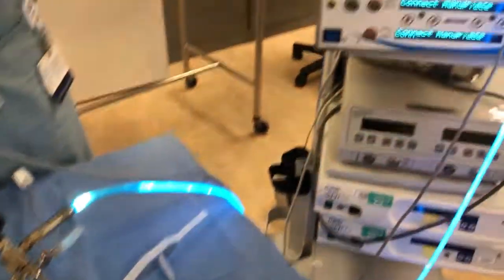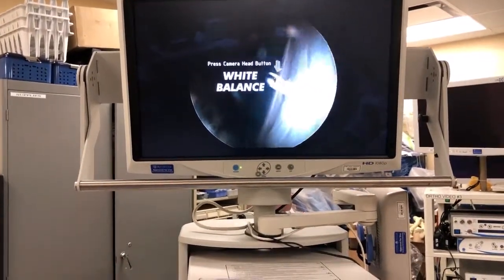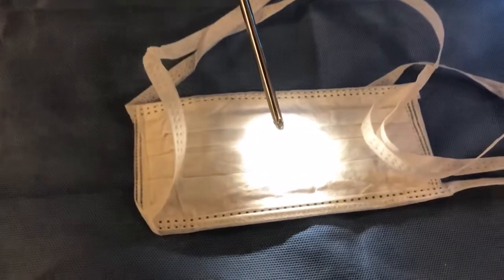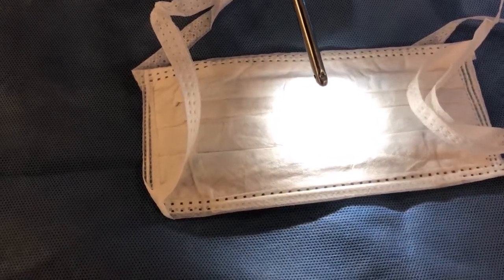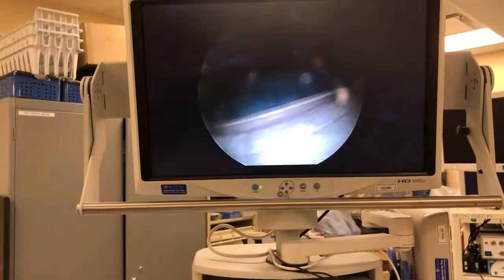The screen may also prompt you to white balance, since we haven't done that yet. White balance tells the camera what color is what — if you get into the joint and cartilage looks green or an unexpected color, your white balance is likely off. To fix it, hit a camera head button and there will be some indication the white balance is set. Now when we look at the screen we can see we're looking at something white and we're ready to go.